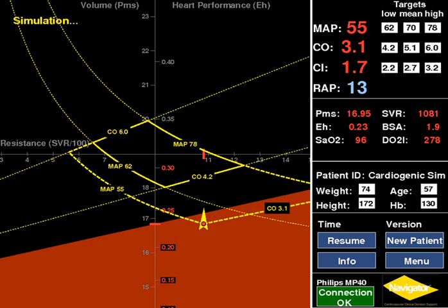Red tick marks on the three scales show the position of the patient. Secondly, you can see a solid yellow trapezoid in the centre of the graph. This area represents the patient target zone, or PTZ. The size of the PTZ is determined when the clinician enters the target mean arterial pressure, MAP, and cardiac output, CO, values.